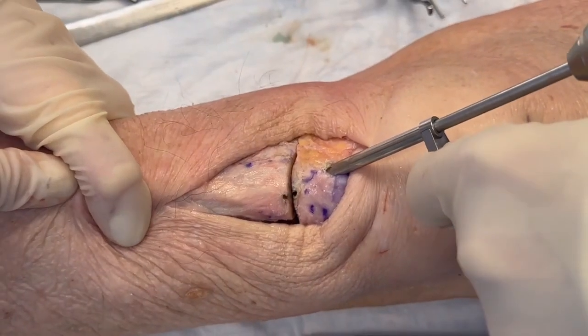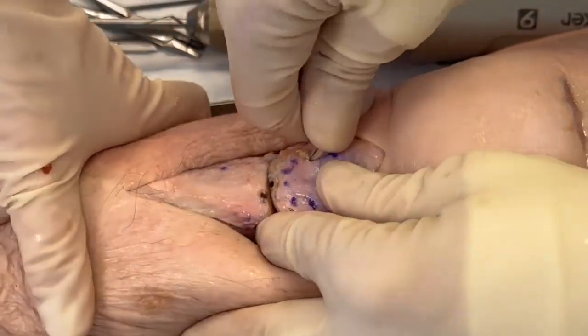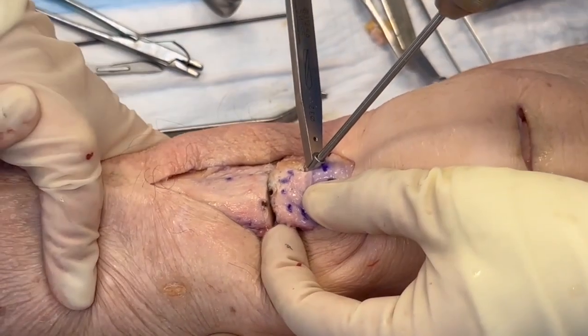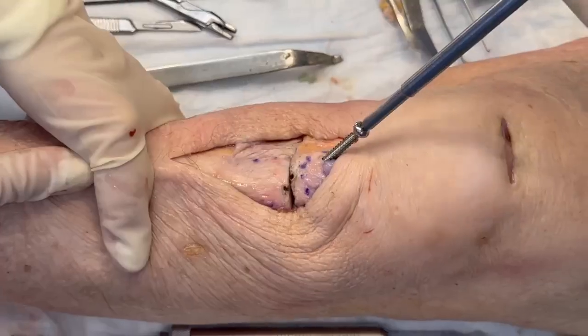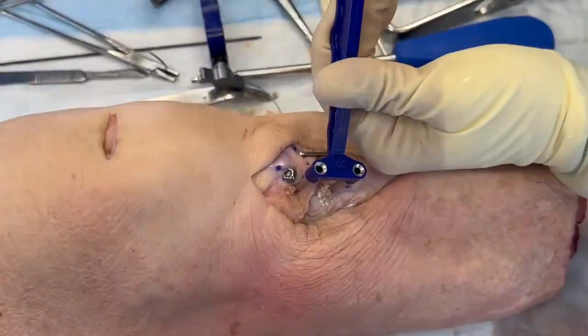Then my preferred technique is one compression screw that goes roughly from the tibial tubercle. So you split the patella tendon, you aim distally, that gives you compression. And I use 4.5 screws. First a 4.5, then a 3.2 drill bit, put the screw in, compress, and then these are staples. I use 2 staples, one medial, one lateral to the screw.